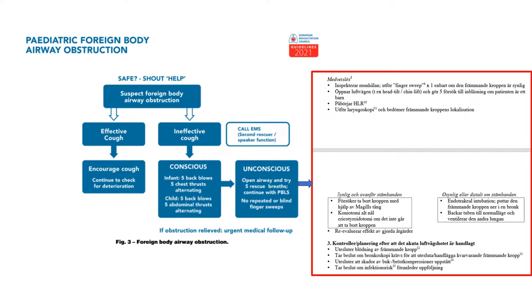We will now go into a bit more detail about what the Swedish Society of Emergency Medicine wants you to know about: that is the needle cricothyroidotomy.